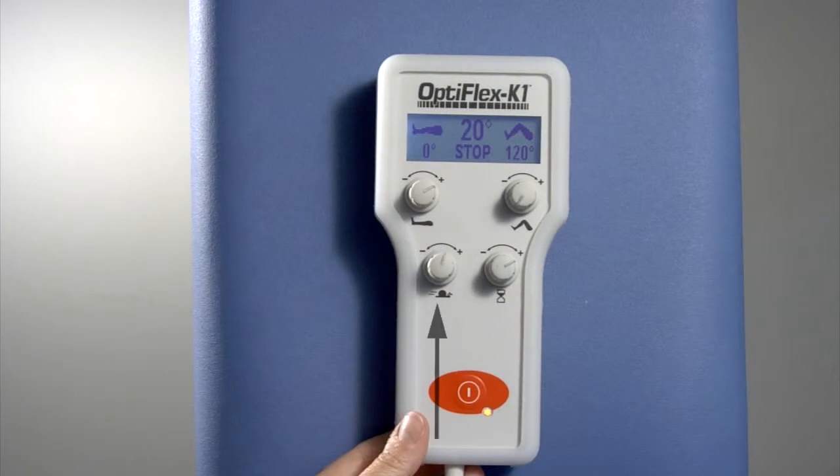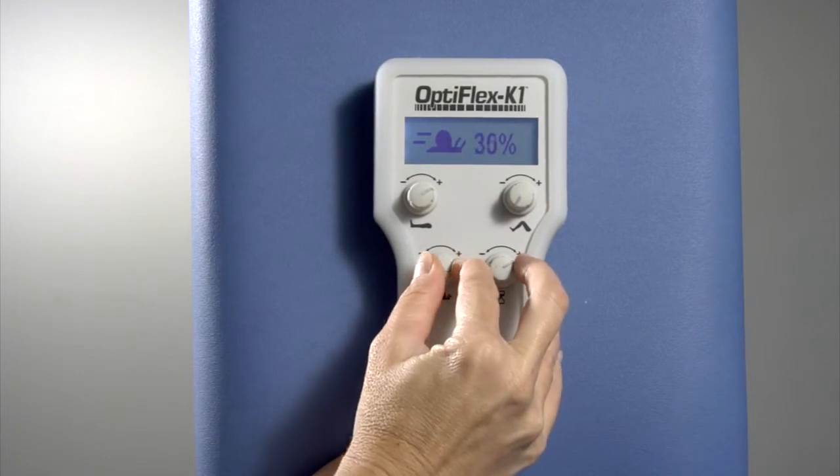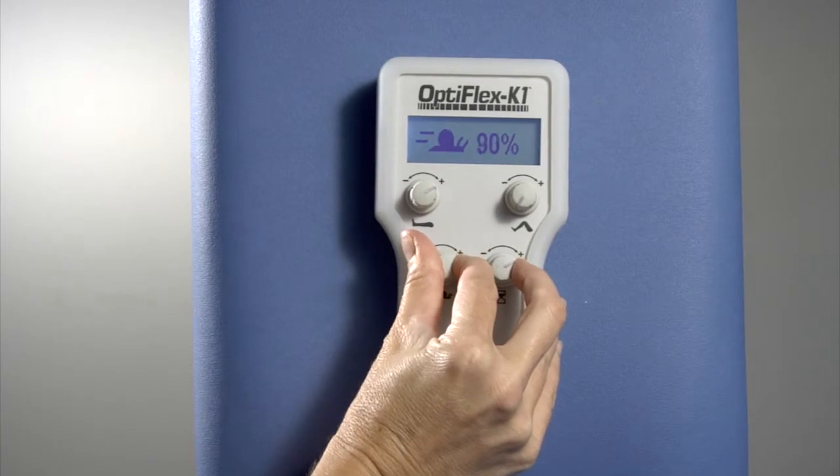To change the speed of the machine, use the knob symbolized by the picture of a snail. Push the speed knob in and turn in the appropriate direction, keeping in mind that this should be set at a comfortable speed for the patient.